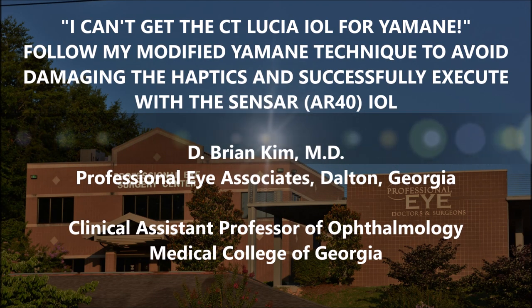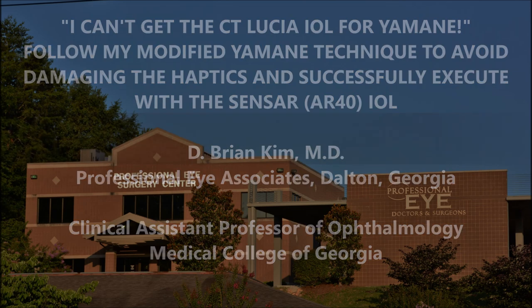Hi, this is Brian Kim. I'm going to share with you in this video how to do the Yamane technique with a Sensar IOL. I've heard many surgeons saying they had difficulty getting a hold of the CT Lucia 602 lens for the Yamane technique. In the United States, it's the only one that has polyvinylidene fluoride haptics, which are very strong and durable. Any other lens we have access to has haptics made of PMMA, which break very easily when you try to manipulate them. I'm going to show you my modified Yamane technique and how I'm able to avoid damaging the haptics, successfully executing the technique with these modifications using the Sensar IOL. So if you don't have the CT Lucia 602 lens, you can still do the technique with a Sensar IOL.